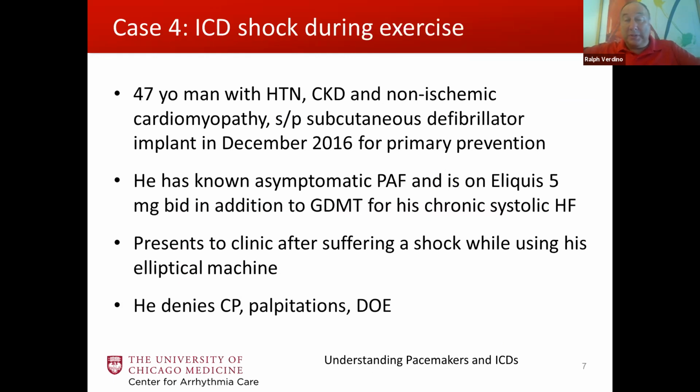So a specific number doesn't rule in or rule out a fracture or an insulation failure. Again, usually they can be way high or way low, but it can point that something may be wrong or heading in the wrong direction. So you like your impedances to be stable regardless of where they are.